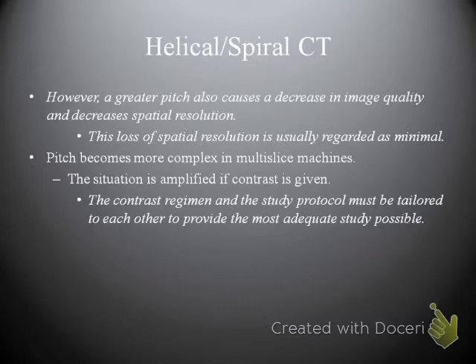But the thing that we really have to worry about in all of this is, if contrast is given, how can we make sure that we are catching the contrast in the proper situation, in the proper organs, in the proper vessels, and doing it adequately and in an expedient fashion? And so how can our protocols be tailored to overcome these hurdles that multi-slice CT sometimes presents because we acquire images so fast? So that's one thing that we have to worry about.